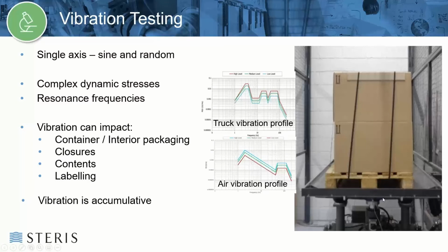This is a photo of a vibration table. So it's basically a table that vibrates over a period of several hours to mimic all the vibrations that your product is going to see driving down the road, flying in a plane, that sort of thing.